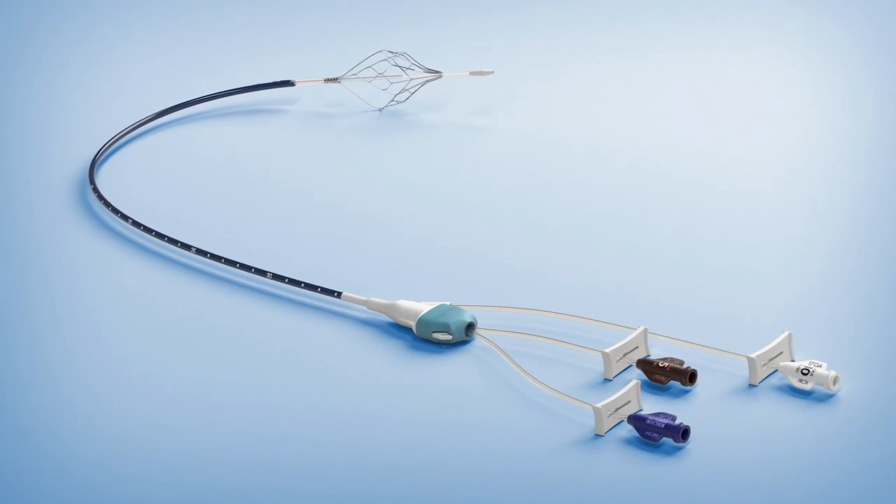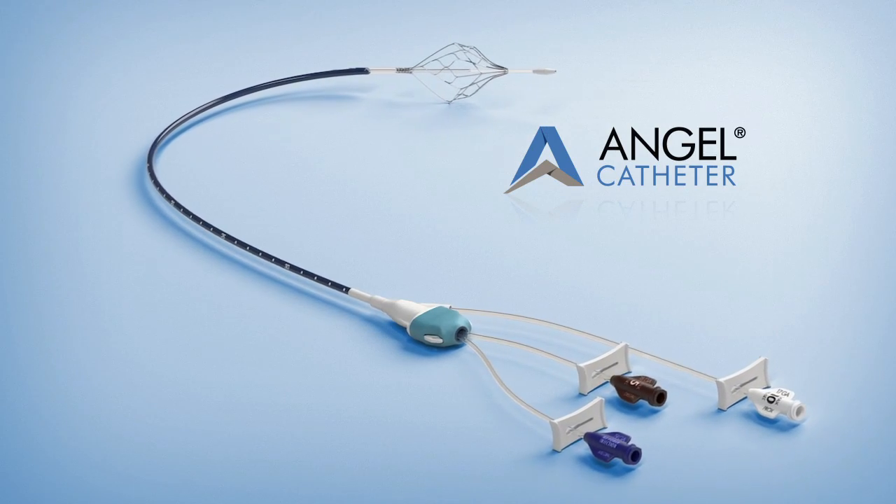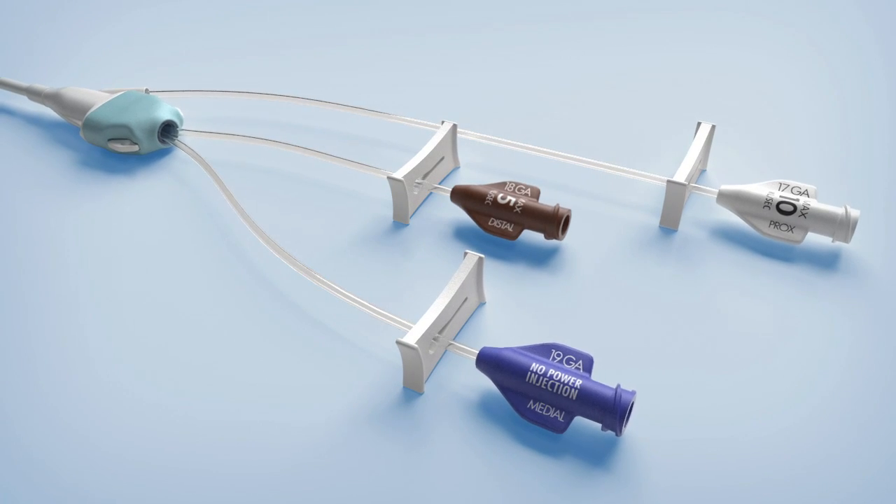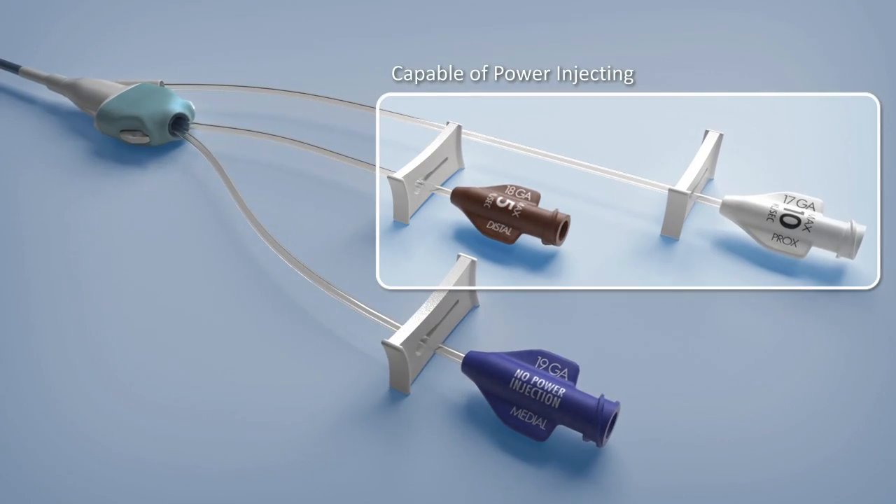Bio2 Medical is proud to announce the Angel Catheter, a novel, retrievable inferior vena cava filter permanently attached to a fully functional triple-lumen central venous catheter.